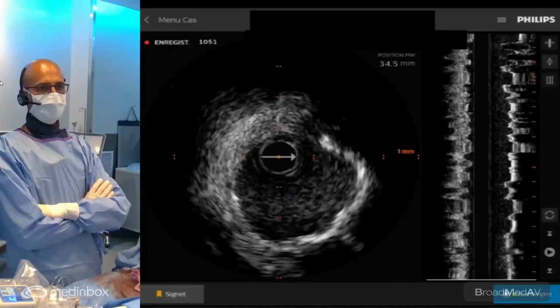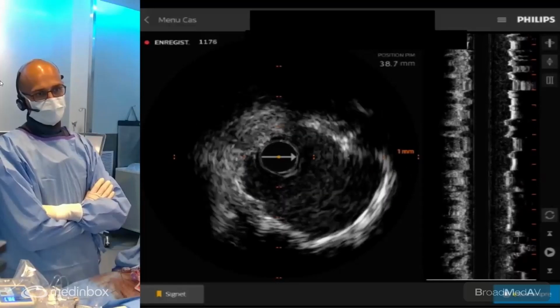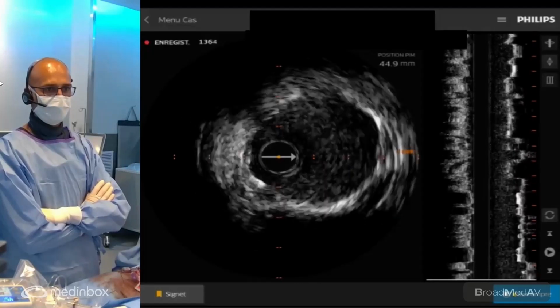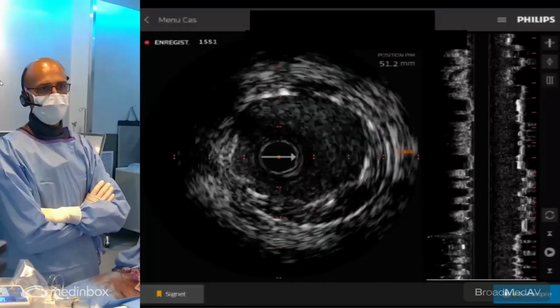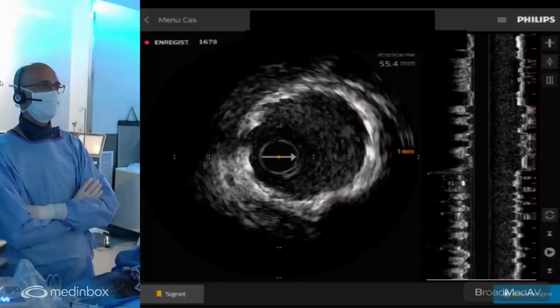Yeah, I think maybe some optimization. Yep, I agree with you on that. Well, there for sure needs some expansion. I think that's where the CTO body was, exactly at the mid segment.